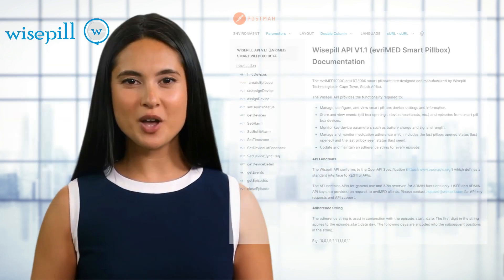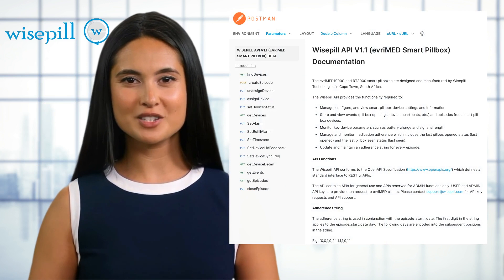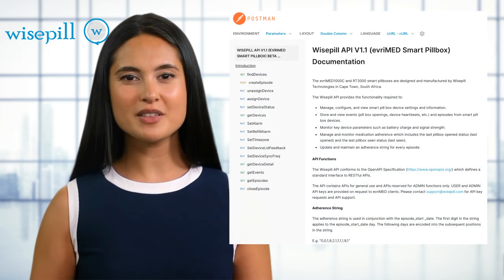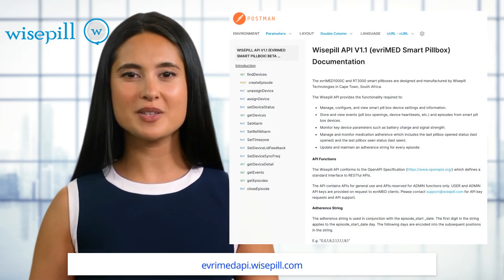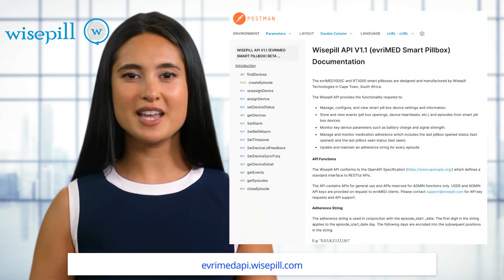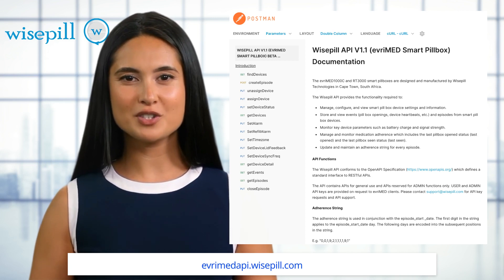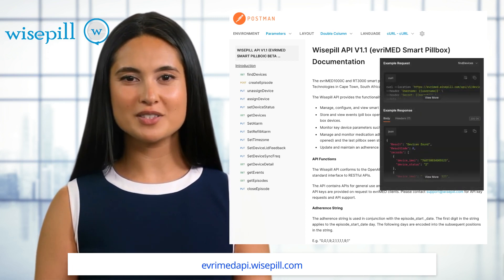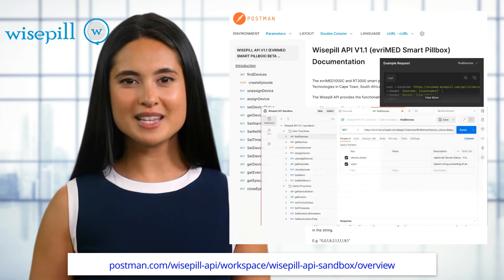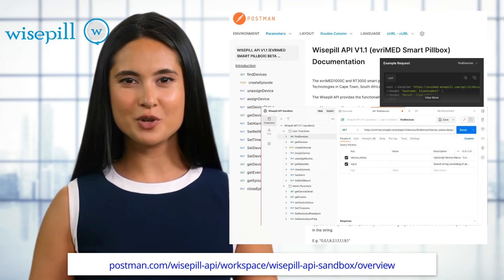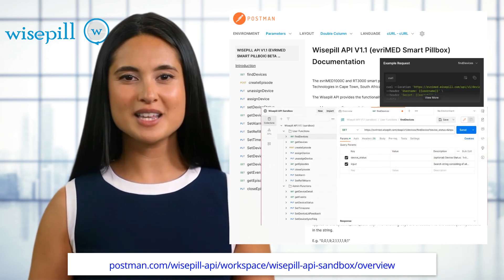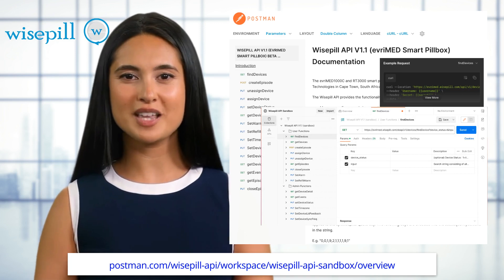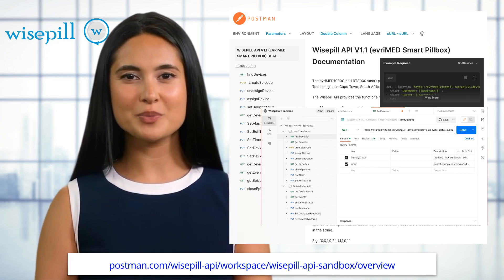The WisePill API documentation link will take you to the main documentation, which provides detailed information on each function call. Example code is given for all function calls. Use the second link to navigate to the Postman workspace where you can access the collection and create a fork so that you can develop your application using the tools provided.